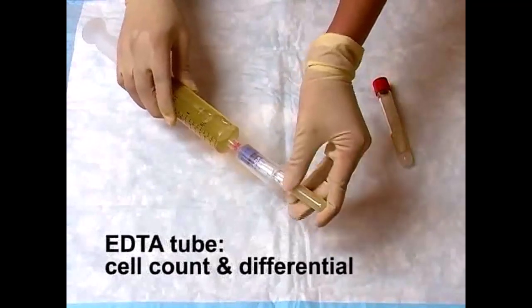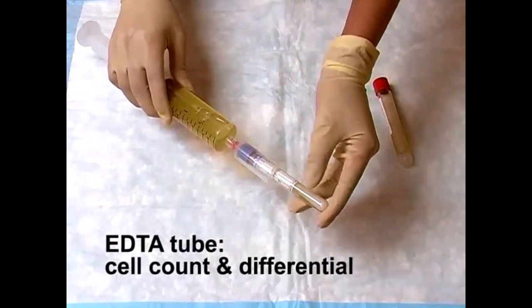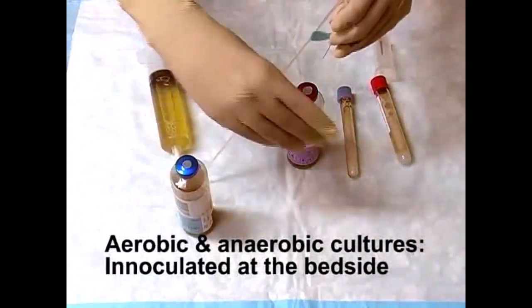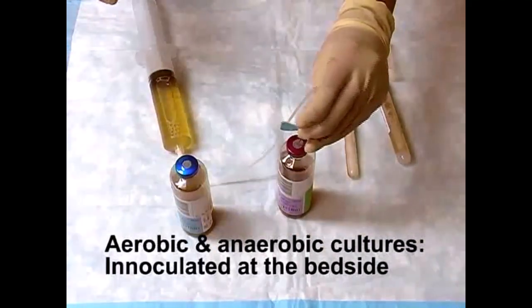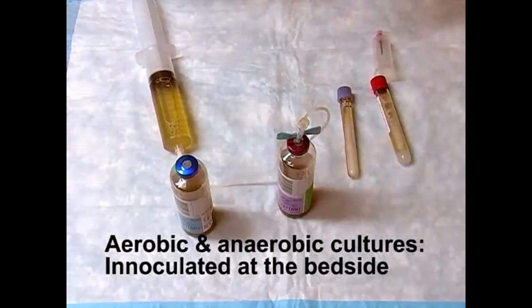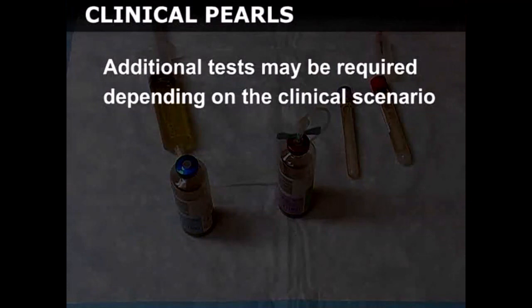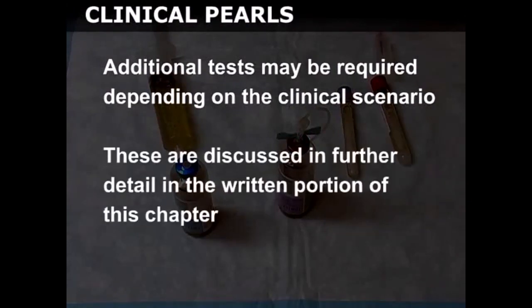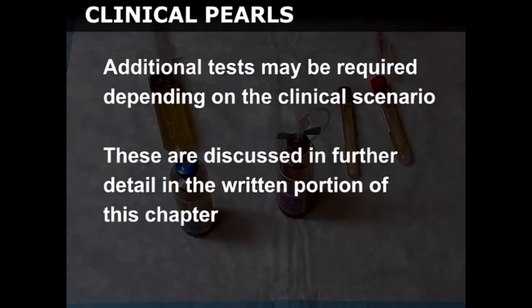An EDTA tube is submitted for cell count and differential. Aerobic and anaerobic culture bottles should be inoculated at the bedside if infectious etiologies are of concern. Additional tests may be required depending on the clinical scenario, and these are discussed in further detail in the written portion of this chapter.